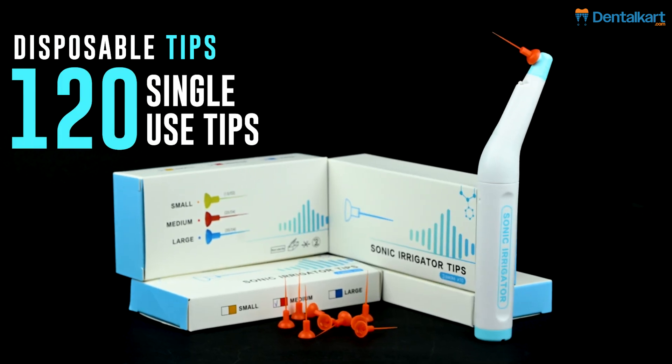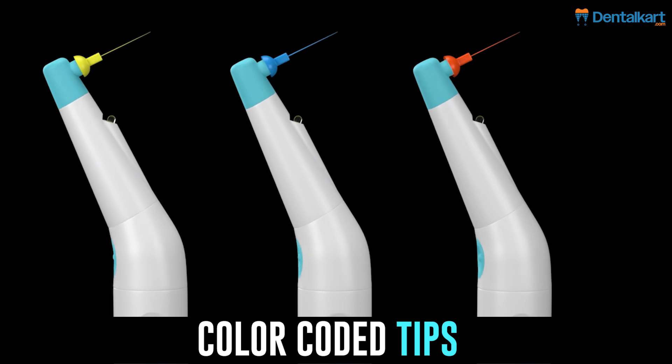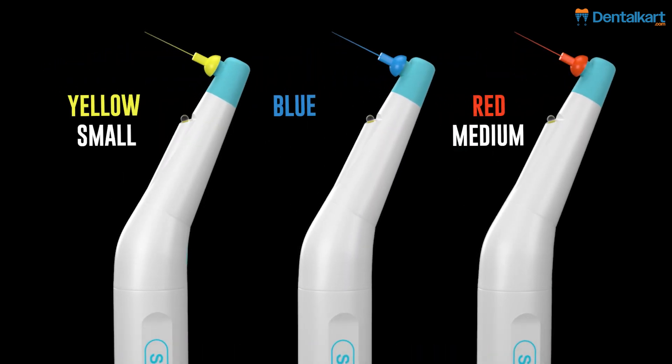Disposable tips: 120 single-use tips — 40 small, medium, and large. Color-coded tips for simplified selection: yellow for small, red for medium, blue for large.